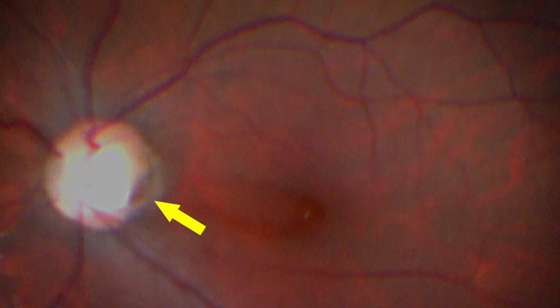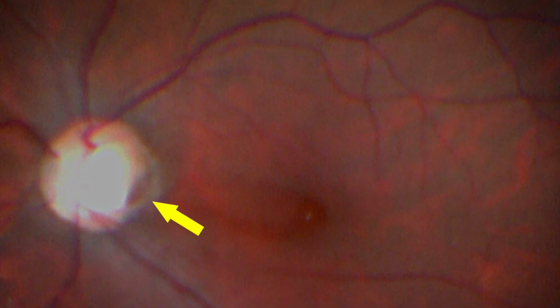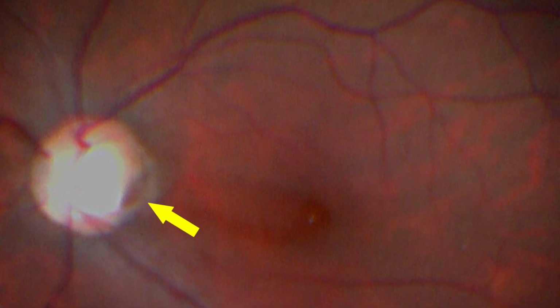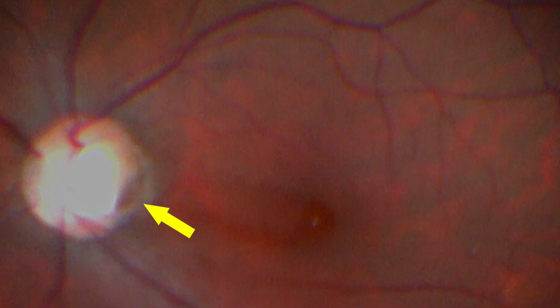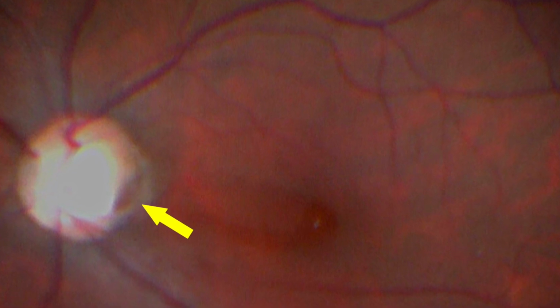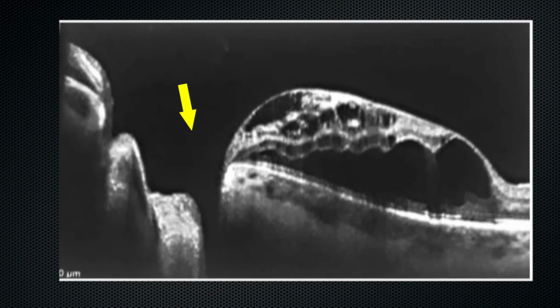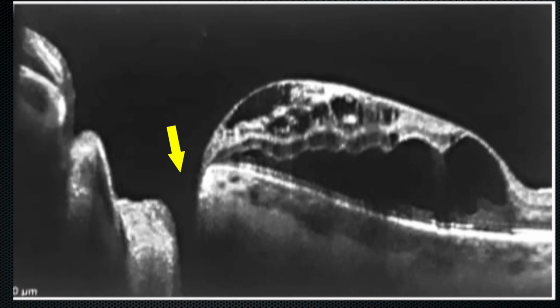Optic disc pit is a scenario where we find the optic nerve pit with central serous chorioretinopathy, which means that the patient has a congenital optic nerve pit which at some point in the lifetime of the patient collects fluid under the macula, which leads to the decrease in the vision of the patient. The OCT reveals schitic changes at the macula.